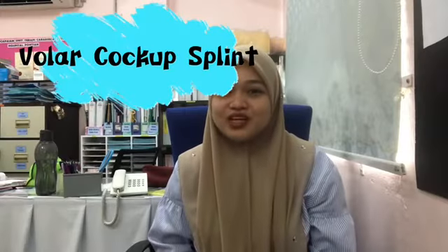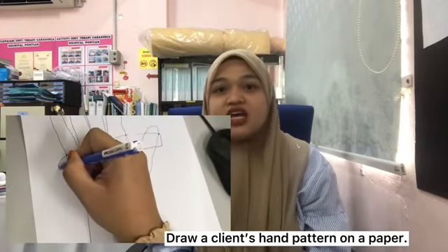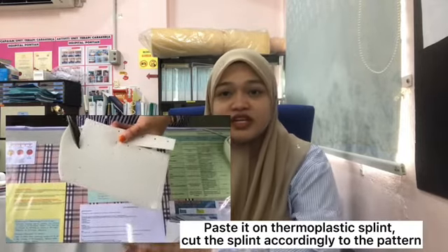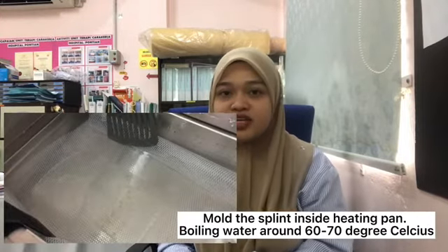Procedure for making a volar splint. First, draw the client's hand pattern on paper. Draw a volar splint pattern and cut it out. Paste it on the thermoplastic splint material and cut the splint according to the pattern. Mold the splint inside the heating pan. The water in the heating pan is boiling at around 60 to 70 degrees Celsius.